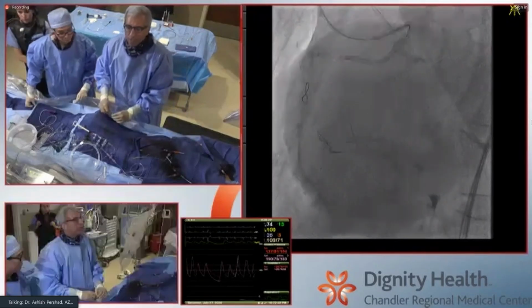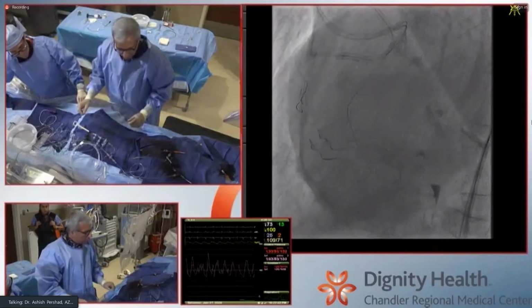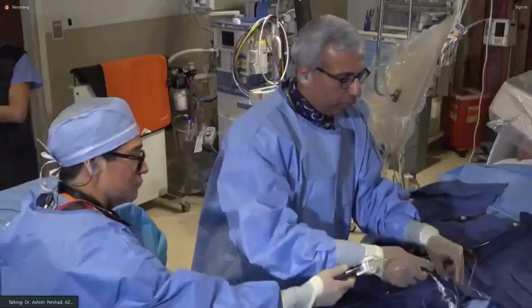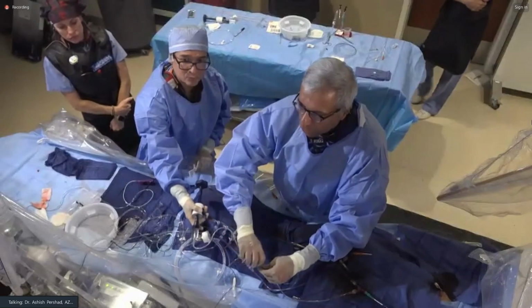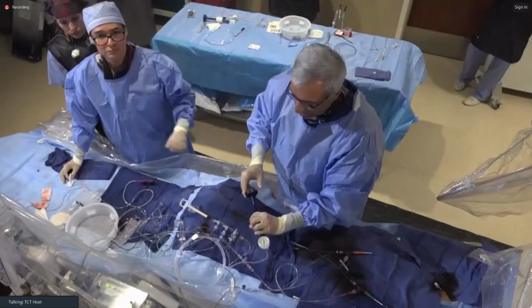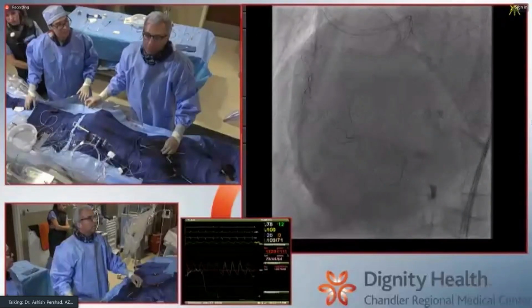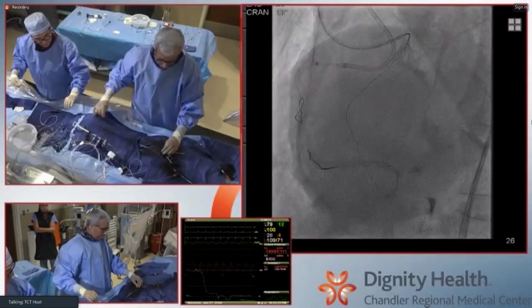So I'm actually going to get my trap liner in a little bit. I'm going to blow up the trap liner balloon in the proximal right, take my microcatheter back, get like a 3-5 balloon in the very proximal right, so I can actually prevent the hematoma and all the dissection antegrade. So that's what I'm working on next. So he's got a Turnpike Spiral antegrade, and a retrograde Turnpike LP 150.